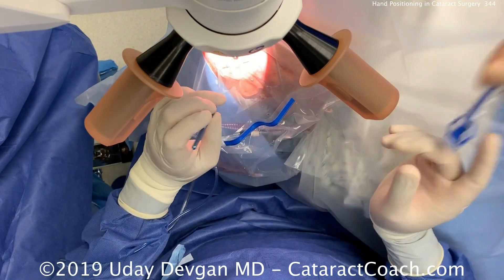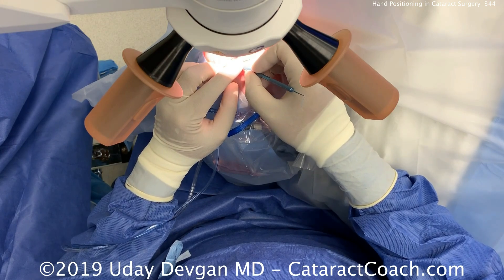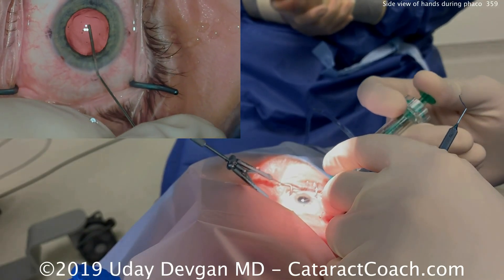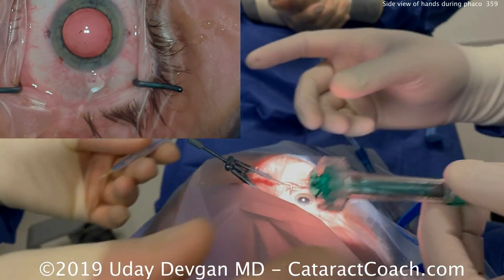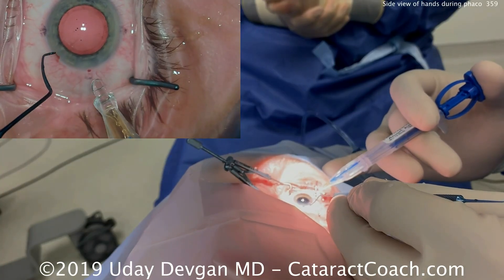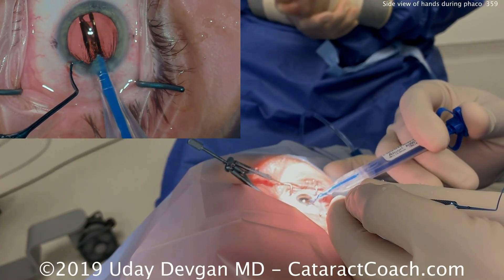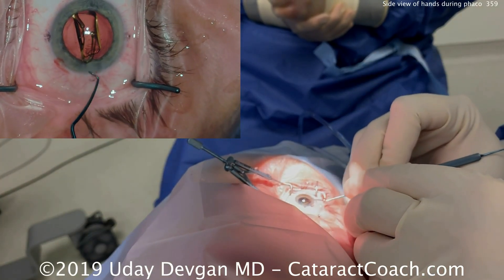The lens goes in the eye. This is a one-handed injector — the older style — just a single hand on the plunger, and I can now get that eye well delivered. Let me show you a slightly different view of a very similar case. Viscous goes inside the eye to fill up the capsular bag — there we go, capsular bag filled up. Now handing me the injector — and now I can fixate the eye, because again we're doing this technique with a one-handed injector. The lens goes right inside the eye.